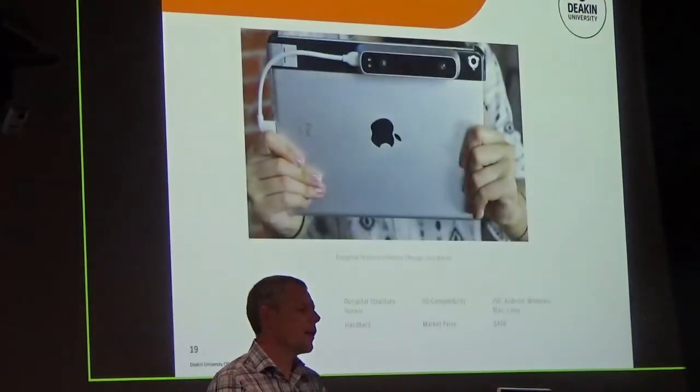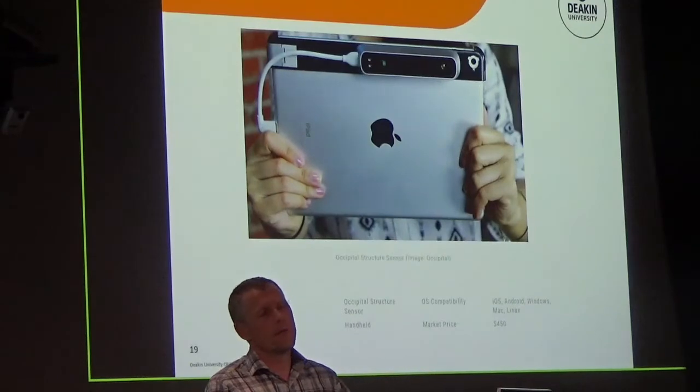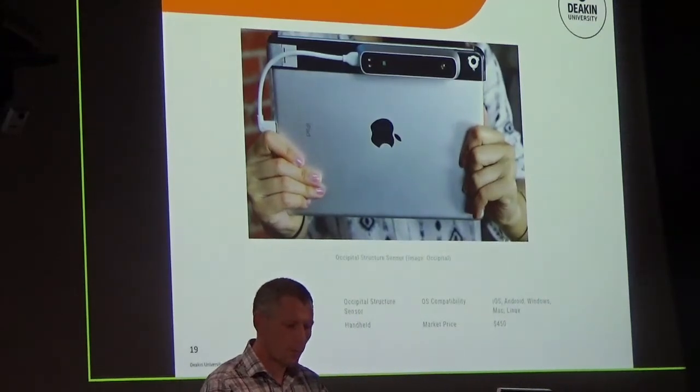So I've got one of these scanners, which I'll show a video of, and basically it plugs into your iPad, really power to a point, and then you scan it and you send the files around, and you can modify them.